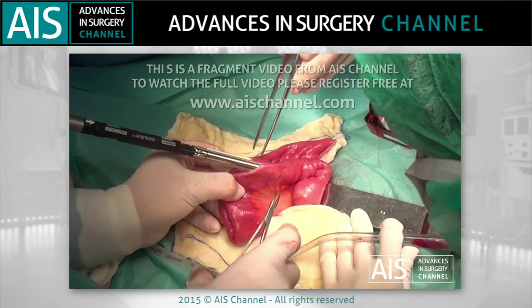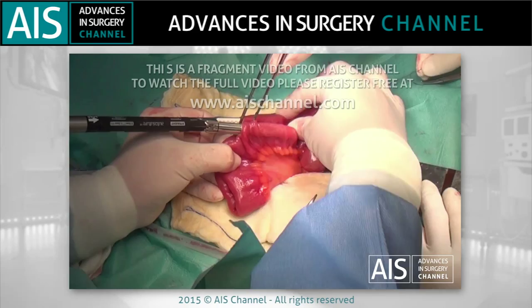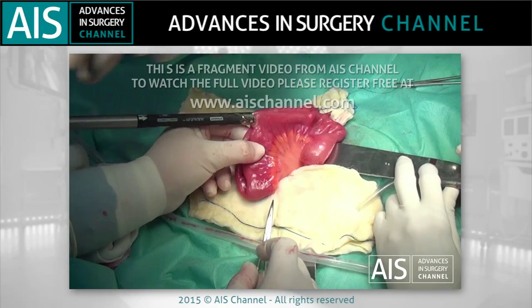An enterotomy is performed on the anti-mesenteric edge at the middle of the future pouch. This is used as a route of entrance for the mechanical suture into the lumen of the small bowel.